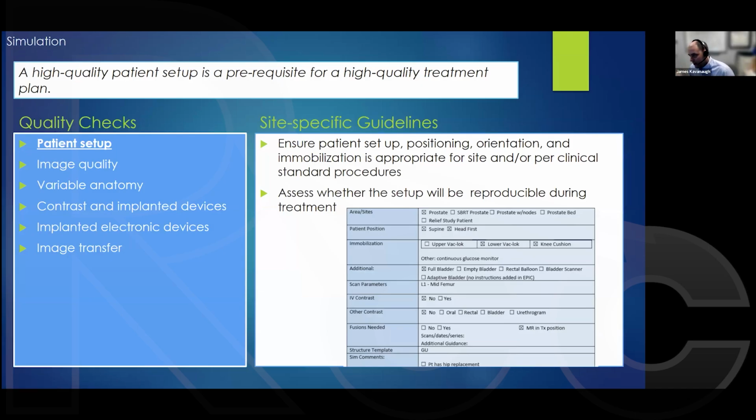So, the same format here, starting with patient setup. We have, and I think many, if not the majority of places, have some sort of instructions that are handed off to our sim therapists. Most of this follows standard of practice. However, we still document it on a patient-by-patient basis because you can never fully assume that they're going to be SOP every single time, every single patient.